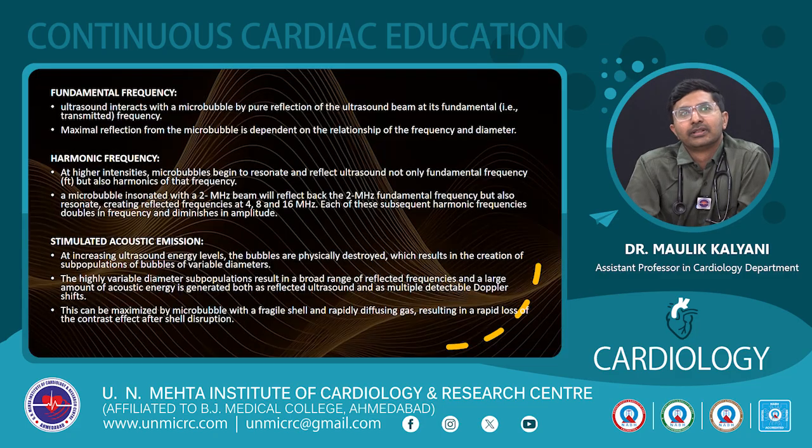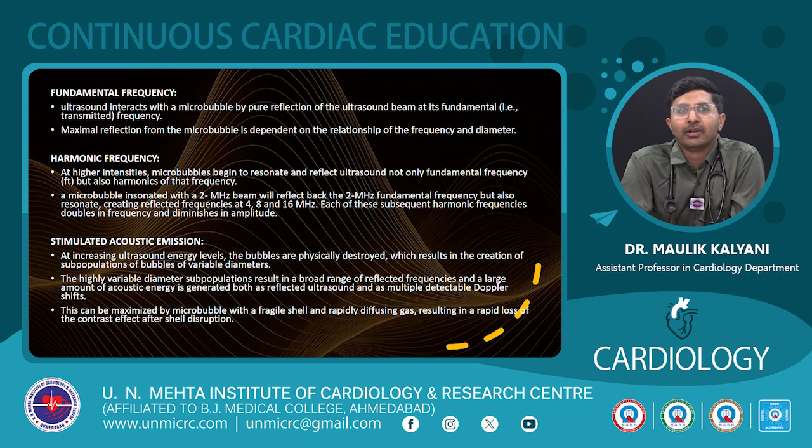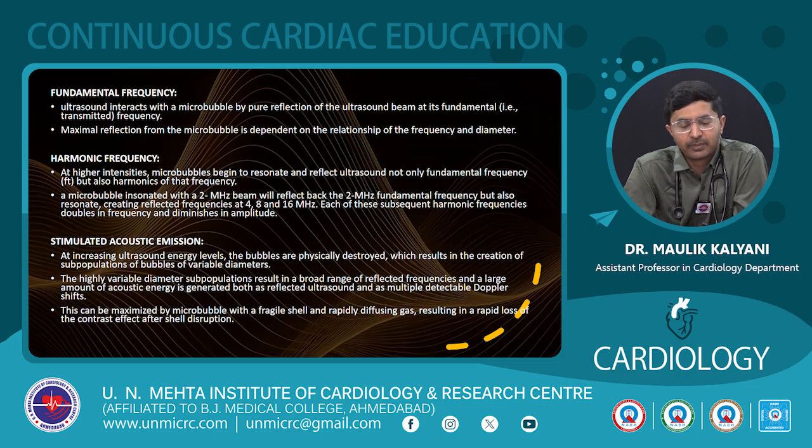So now this is the pure physics part of how ultrasound interacts with these contrast agents. There are three types of responses: fundamental frequency, harmonic frequency, and stimulated acoustic emission. When ultrasound interacts with the microbubble, there will be pure reflection of the beam at the transmitter frequency, also called the fundamental frequency, and it depends on the size and the frequency that was transmitted.